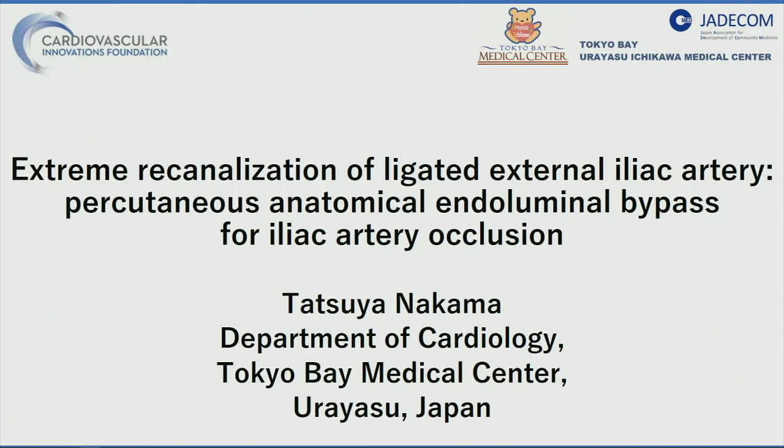Actually, in this case, we confirmed all of the artery and vein positions using the IVUS. After that, we tried to use the OUTBACK. Of course, Pioneer is promising, but in Japan, Pioneer is not reimbursed. So, Pioneer is like the OUTBACK, just with the ultrasound on it, right? I think it's a great idea.